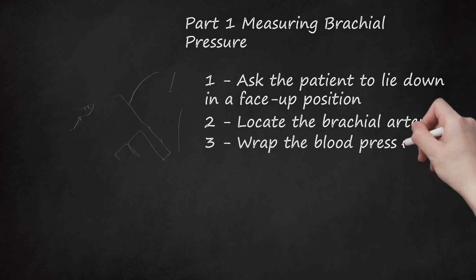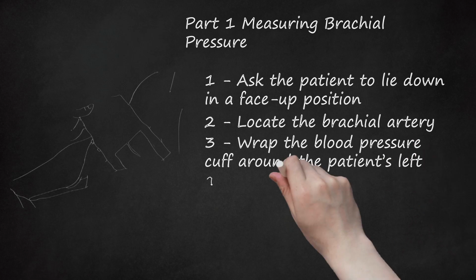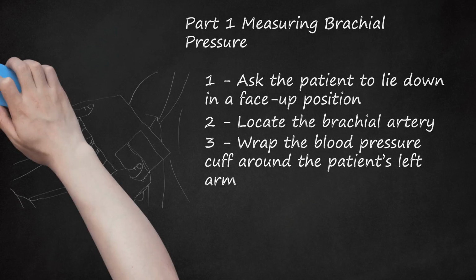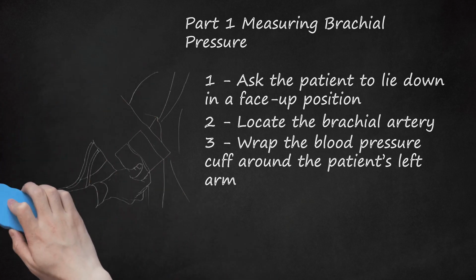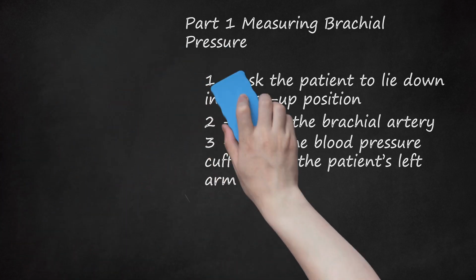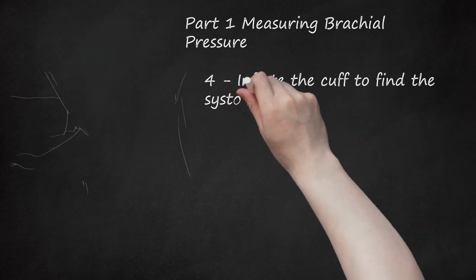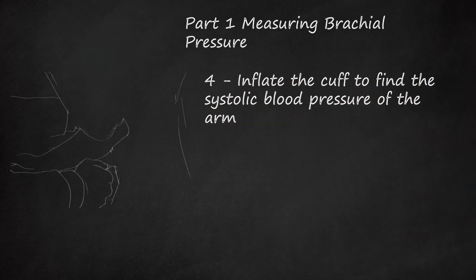3. Wrap the blood pressure cuff around the patient's left arm. Make sure that the cuff is placed about 2 inches above the brachial pulse site. To avoid inaccurate readings, make sure that the cuff is loose enough that it can rotate around the arm slightly, but not so loose that it could slip down the arm. If possible, use a blood pressure cuff that has a width that is approximately 2/3 of the length of the patient's arm.